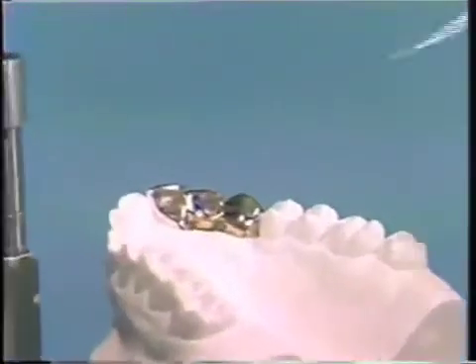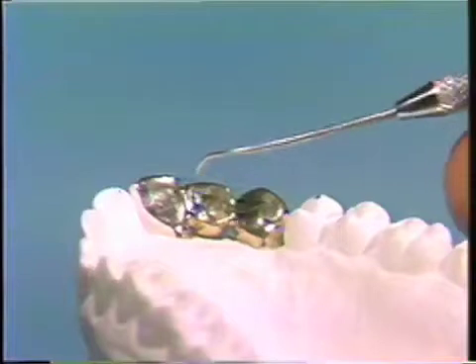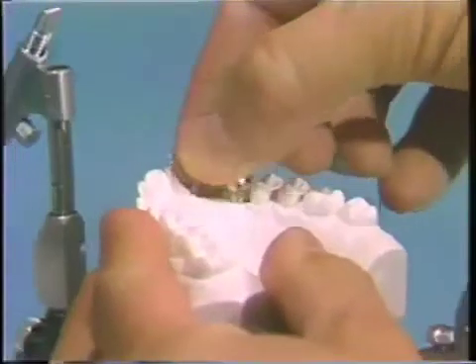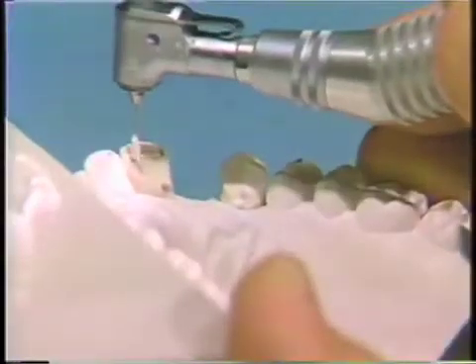There should be centric stops on the pontic and both of the abutment castings. The margin should be very smooth with no catches or overhangs. If this is correct, then the bridge will be cemented with a temporary zinc oxide eugenol cement. The same spiral will be used to spin the cement down the pinholes.